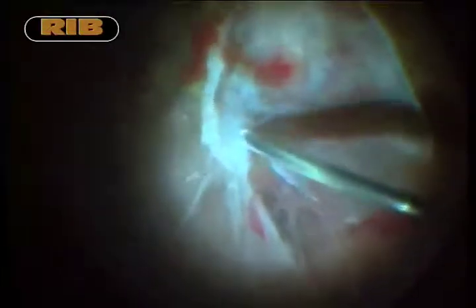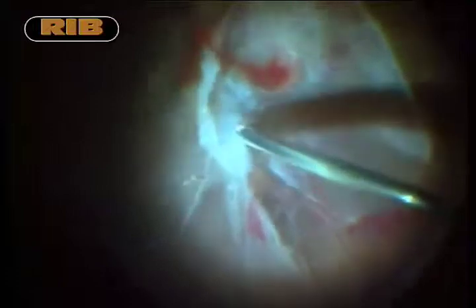The modern MIVS cutter acts as a multifunctional tool. It can act as a pick to find an edge and lift the membranes. It can also allow us to do blunt dissection of the membranes.